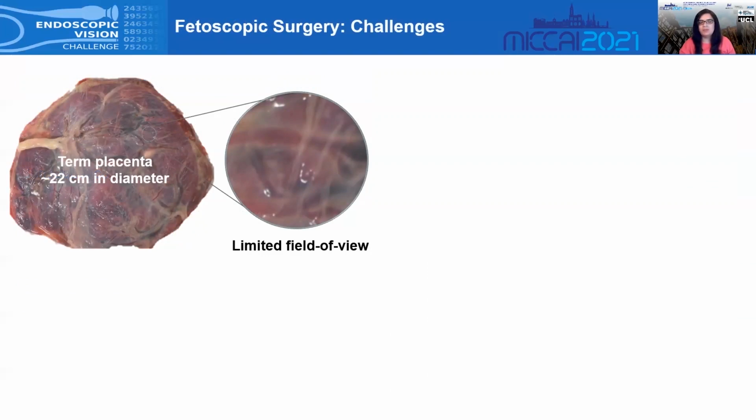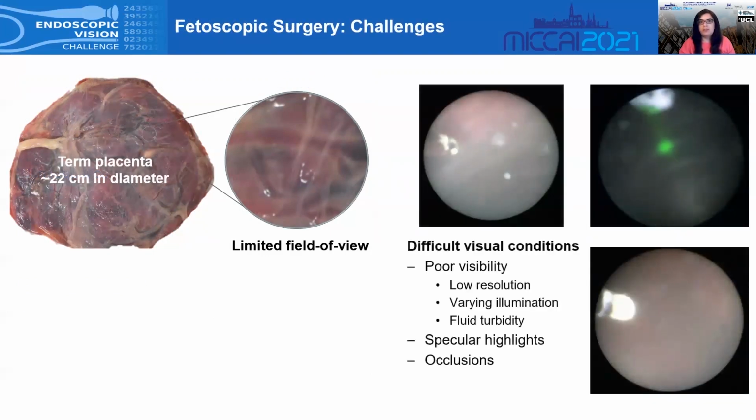This is a highly challenging procedure because the field of view is very limited. Moreover, the visual conditions are very difficult, and they vary a lot from one patient to another. As you can see in these 3 examples, there are conditions such as poor visibility, low resolution, varying illumination, fluid turbidity, and also specular highlights and occlusion occurring in a fetoscopic scene all the time.